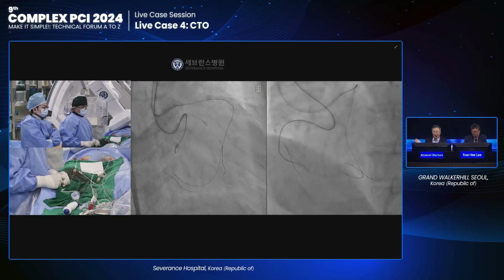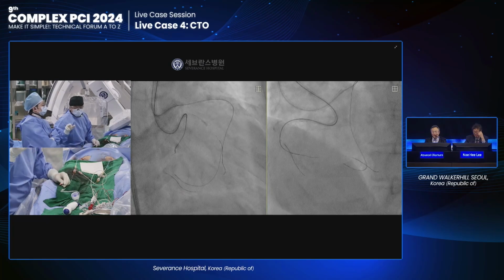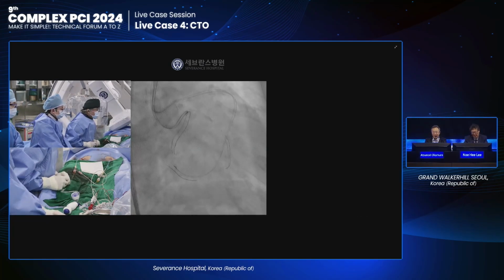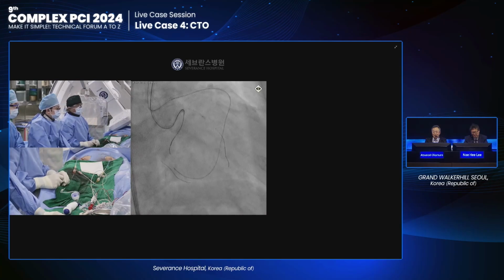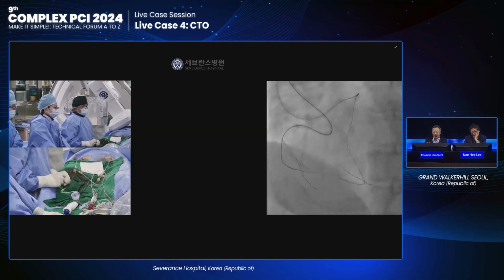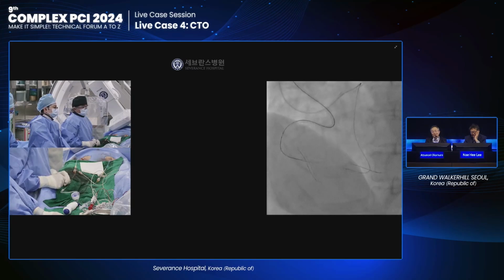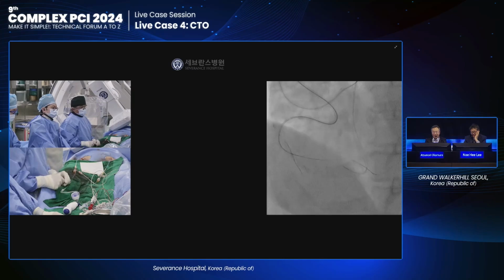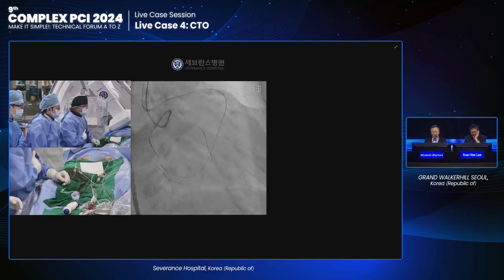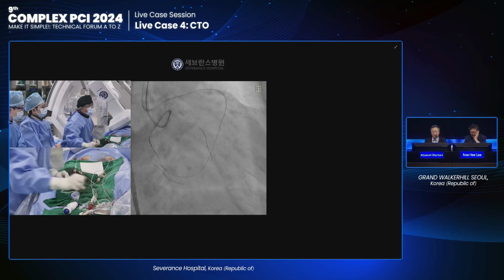Yeah, Dr. Hirohata clearly mentioned. So inside the vessel, Gladius and do the IVUS and tip detection or ADR. But if we want to keep the intraplaque tracking, not using the IVUS-guided wiring, doctors will choose the Gaia, like Dr. Kim. Dr. Kim, okay, how is the feeling?